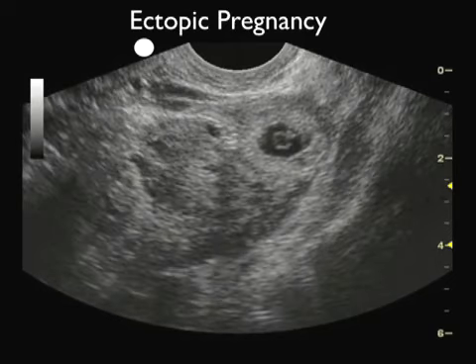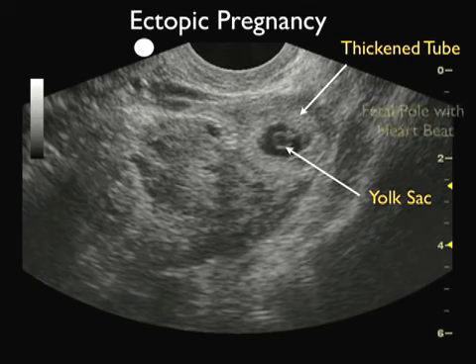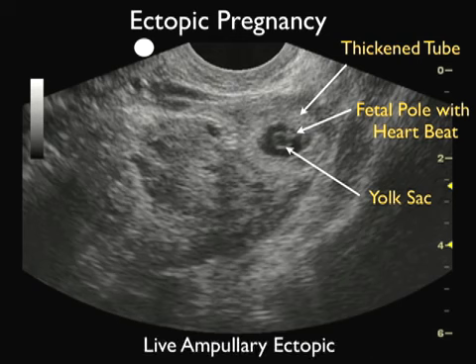So go ahead and still down that image. What we see here is a thickened fallopian tube, and inside the thickened fallopian tube we can make out the chorion or the yolk sac, and we can actually see the fetal pole. Now as I scan through that area with video, we could see the flicker of a heartbeat indicating a live ampullary ectopic pregnancy. So another flavor of ectopic pregnancy where we can actually make the diagnosis by visualizing the ectopic pregnancy directly within the fallopian tube.